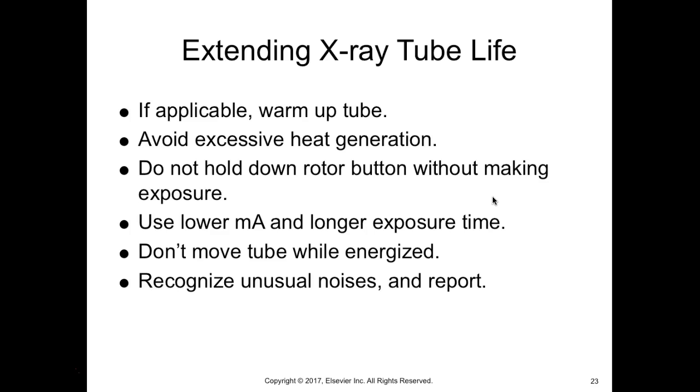You want to avoid excessive heat generation, and don't hold down the rotor button without making an exposure. So a lot of your techs are saying, okay, rotor and then expose. You're not supposed to do that, and they're all going to argue with you, but do know that you are supposed to hit it all the way down, and once the anode gets to speed, it'll make the exposure, and that's going to extend the life of the tube.